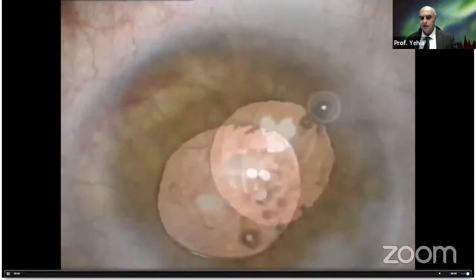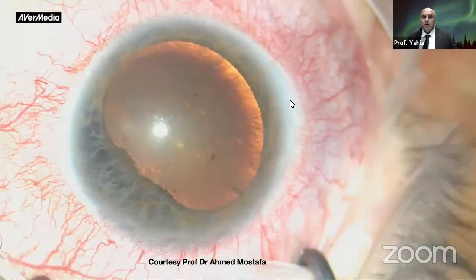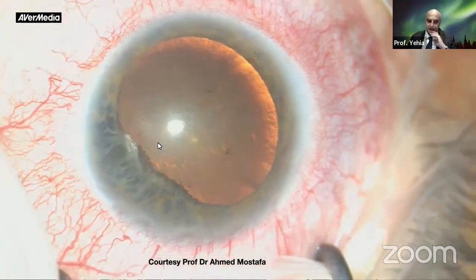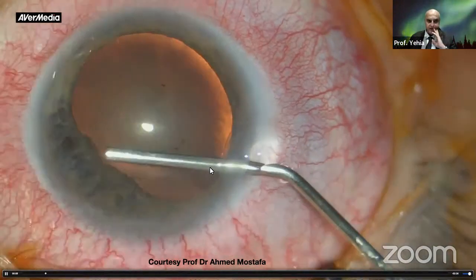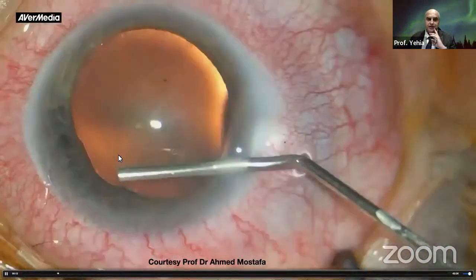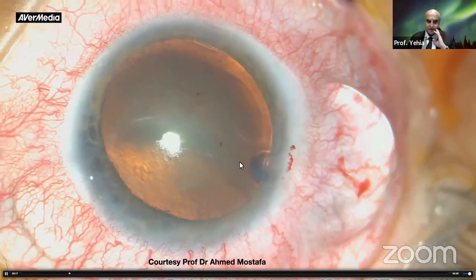And here you don't need to suture. As you have seen here, the visco and mechanical goniosynechiolysis is actually blind. So it's better to do it under vision using a direct gonioscope. So this is again another video, a nice video in a patient with chronic angle closure glaucoma. Posterior synechia from previous attacks, dissected easily because it's in one sector.